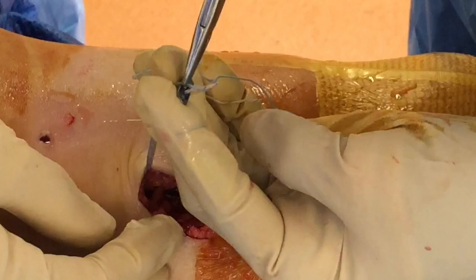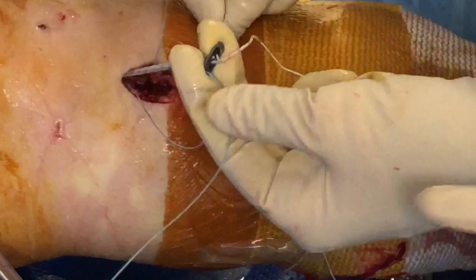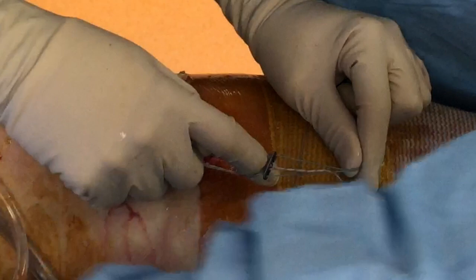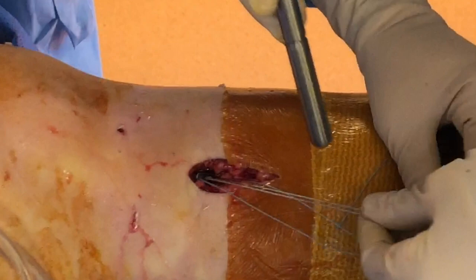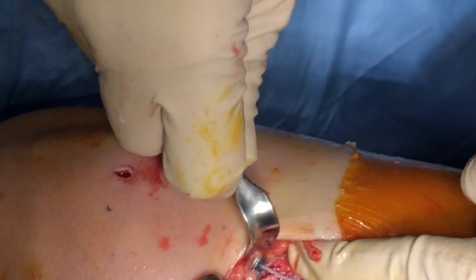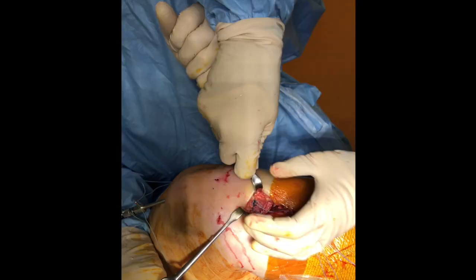George is going to put his finger there and I will pull. Same mechanism as the femoral end — the graft is now going to be tightened. We want to make sure there is no soft tissue in there, and you just tighten it as much as you can. You can see it's sitting flush against the bone, and that acts as an external suspensory anchor for the graft.